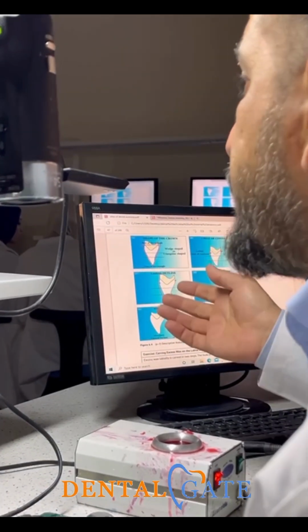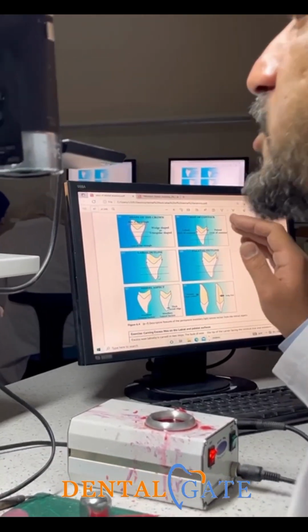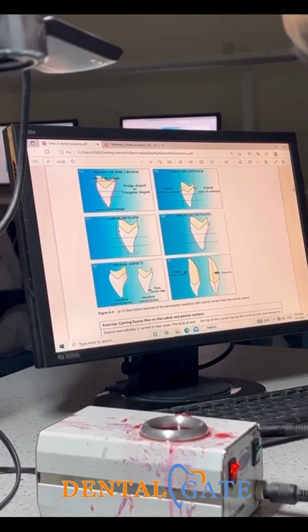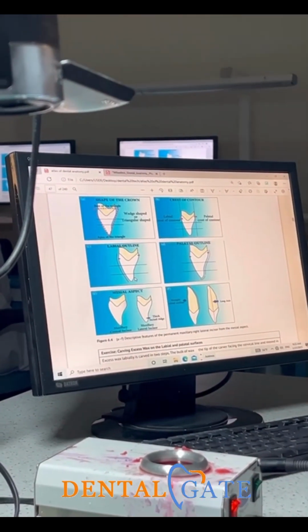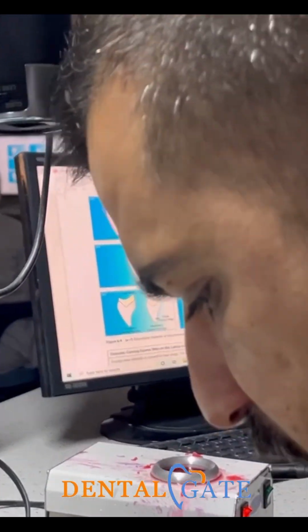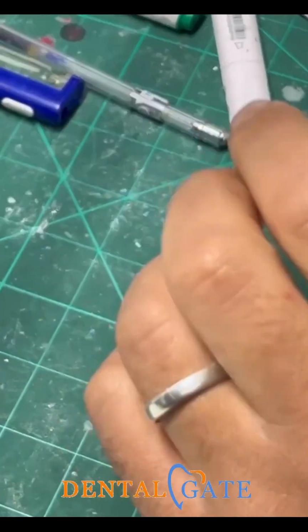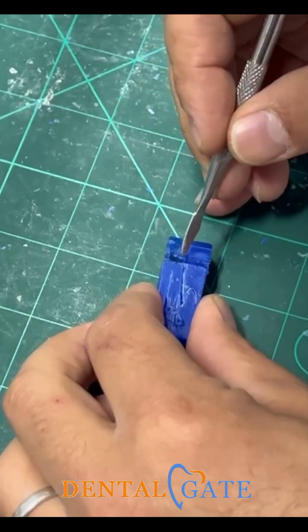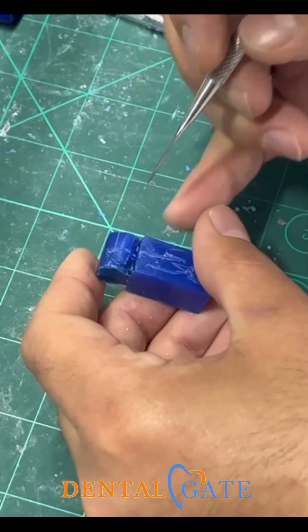I will add my carving, okay. This is not the final shape of the lateral, but it will assign the good principle for the carving, okay, to avoid mistakes. I need fundamentals to start with the carving. So this is very easy because I have a 5 millimeter here, because in the lingual side we have the 5 millimeters here, and we have a 6 millimeter. Please pay attention to this.